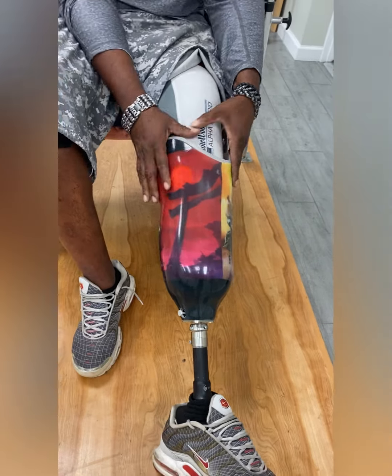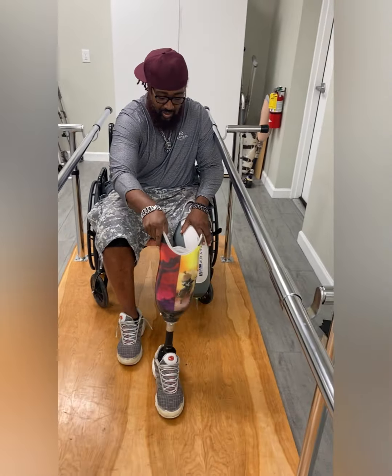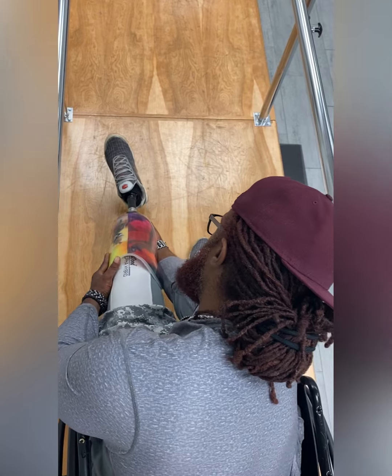Consult your prosthetist for any questions. Here is another view on how to remove your leg. Simply push and hold the button in and slide your limb out.